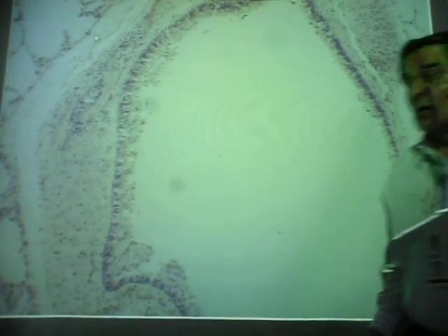Okay. So when you're looking at these things, first of all, any cartilage in the wall, it's tertiary. There's cartilage, it's tertiary bronchus, okay, easy, regardless of the shape or the size. No cartilage, and it's a bronchiole, terminal bronchiole, or respiratory bronchiole. If it's got alveoli coming off, that's a respiratory bronchiole. No alveoli, and it's a bigger one, about the size of respiratory, then it would be a terminal bronchiole. Now with the terminal, what I'll probably do is just give you one that's adjacent to the respiratory bronchiole, so there's no gap.